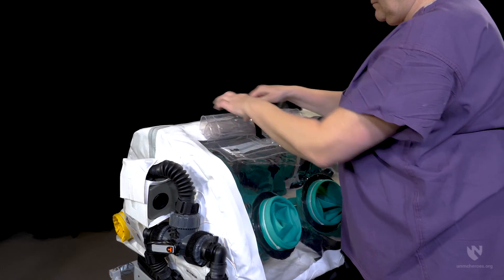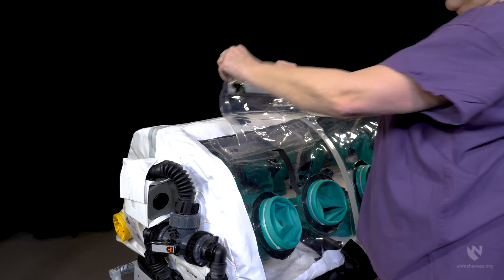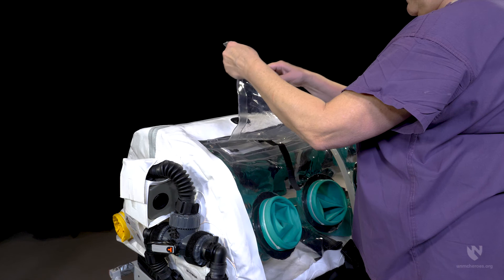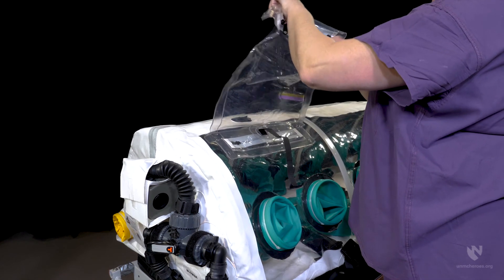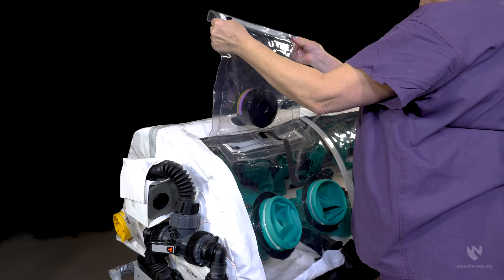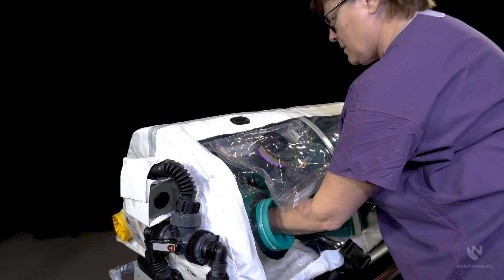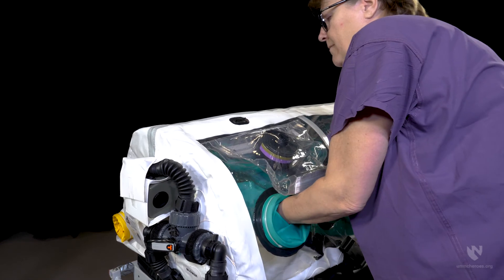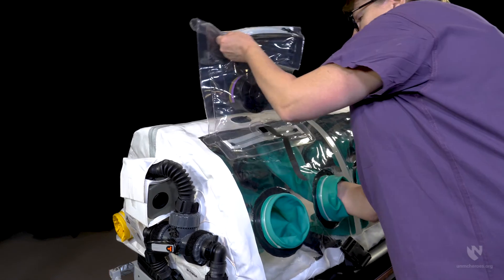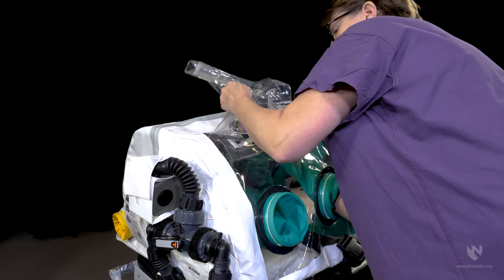The vertical drop bag is used for introducing clean larger items into the enclosure. The bag has one zipper on the outside and one on the inside that opens into the interior of the unit. Before placing an item into the bag, be sure the interior zipper is closed. Place the item in the bag via the outside zipper and close when done. Using the glove port closest to the bag, open the interior zipper, remove the item from the bag, and close the zipper.